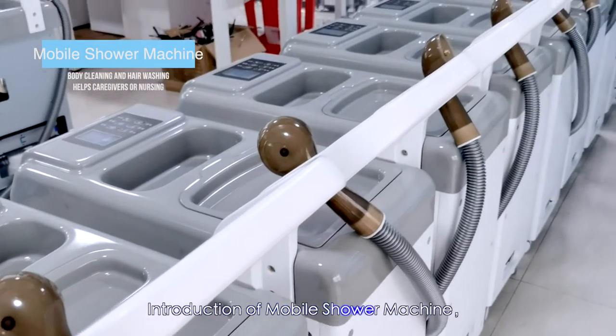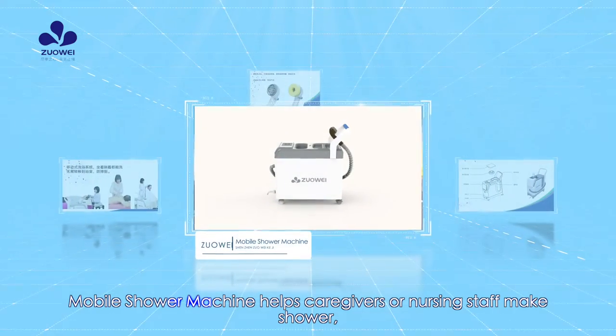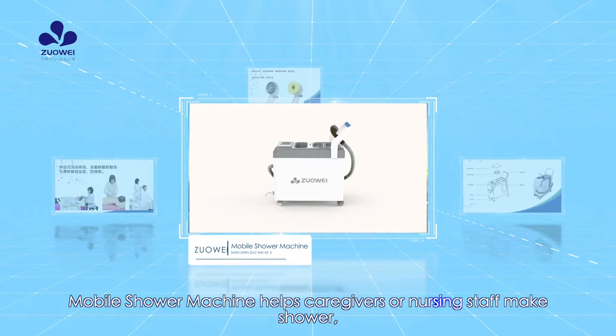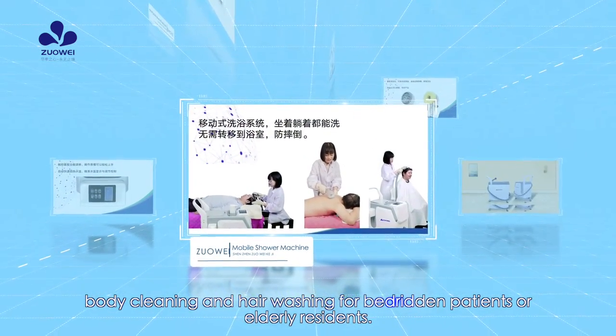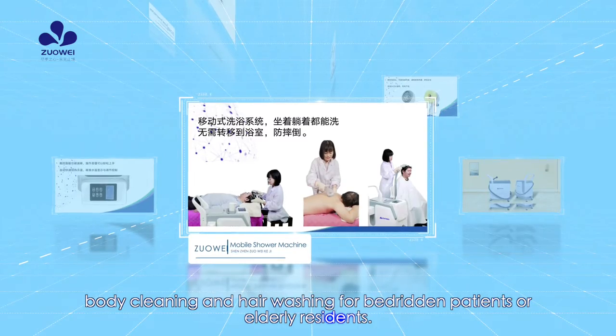Introduction of Mobile Shower Machine. The Mobile Shower Machine helps caregivers or nursing staff perform showering, body cleaning, and hair washing for bedridden patients or elderly residents.